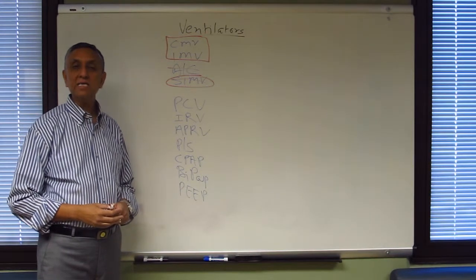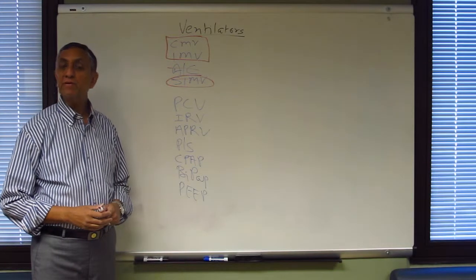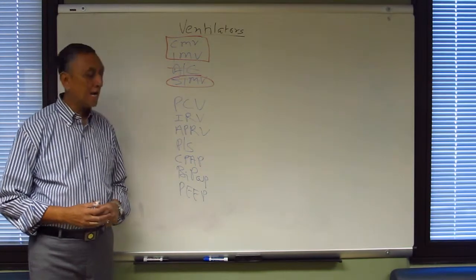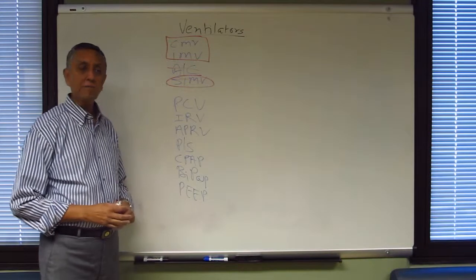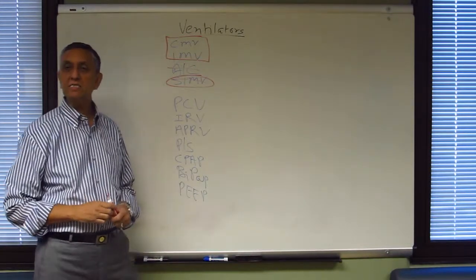So what will that lead to? What are the ramifications? Hypoventilation. Hypoventilation is the real problem. Then why do we put patients on pressure control ventilation? What's the indication?